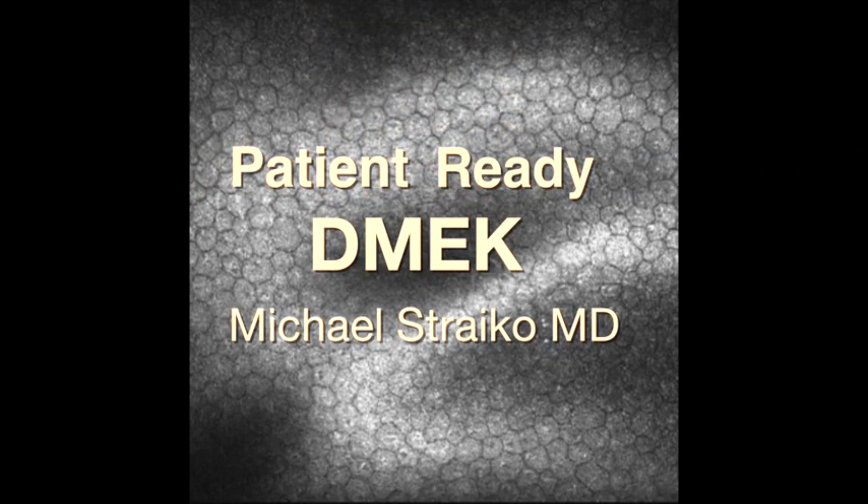Hi, this is Mike Straiko with the Devers Eye Institute in Portland, Oregon, and I'm excited to talk to you about my latest DMEK technique. This technique features DMEK tissue that has been pre-stripped, pre-cut, pre-stamped, and pre-stained and pre-loaded into a DMEK injector at the Lions Vision Gift Eye Bank in Portland, Oregon.